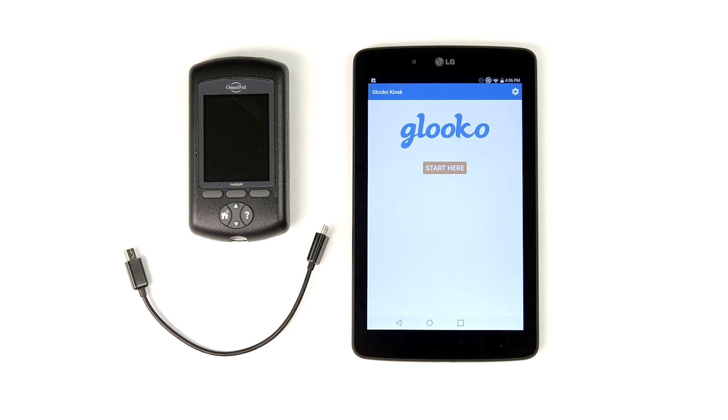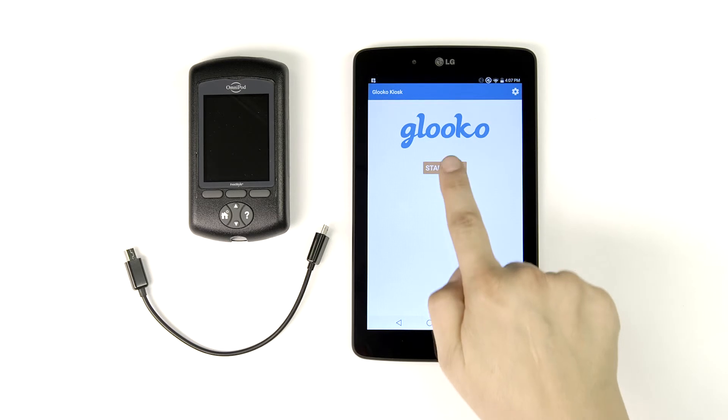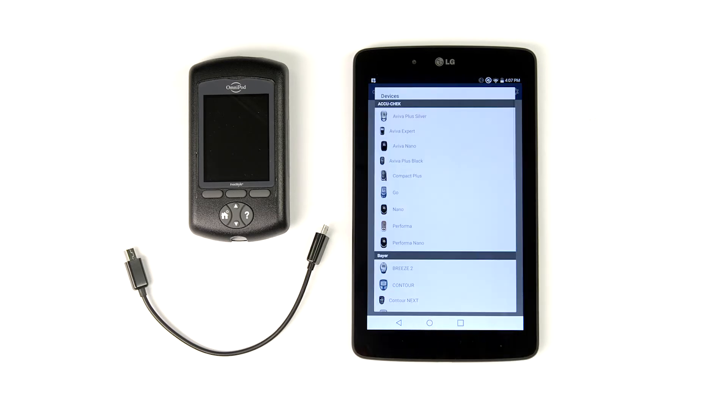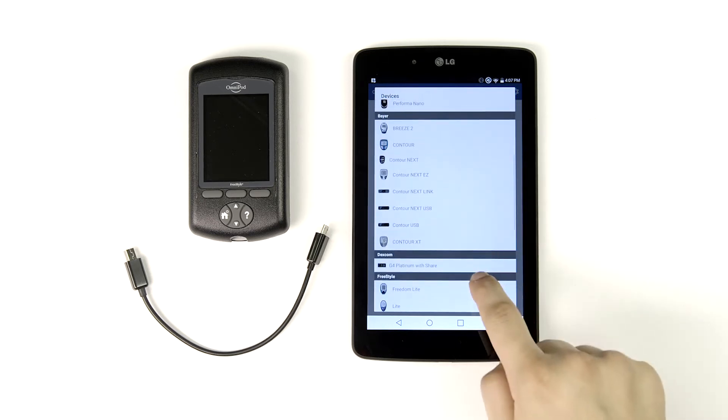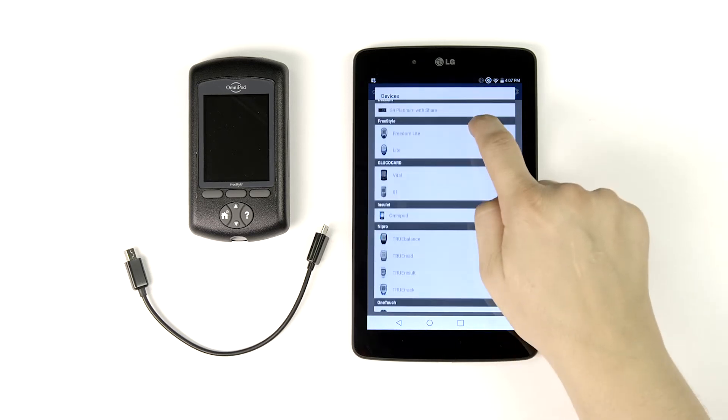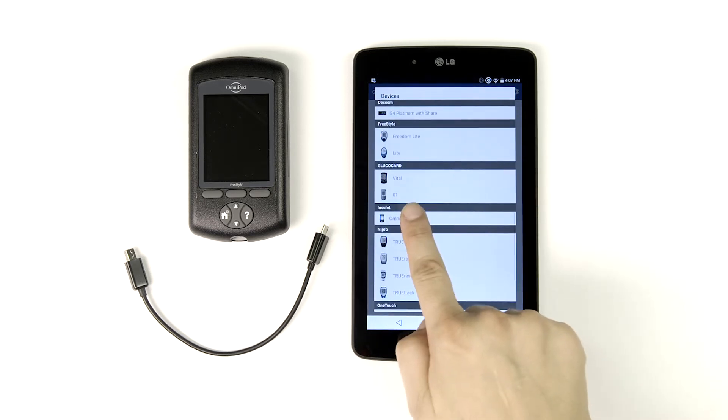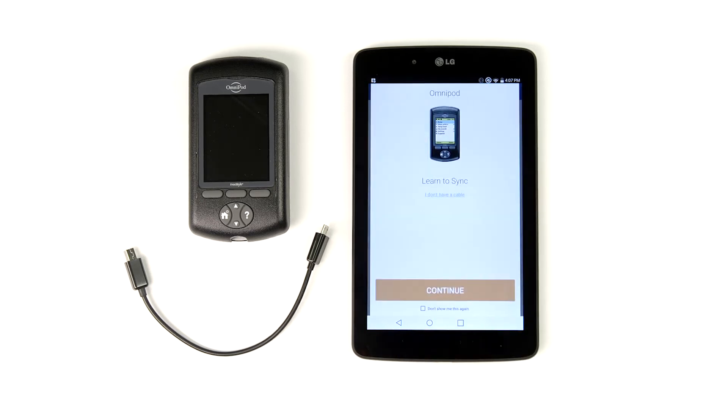From the kiosk home screen, tap start here. You'll find our list of supported diabetes devices. Scroll until you see Insulet Omnipod. Tap Omnipod to open the Learn to Sync screen.